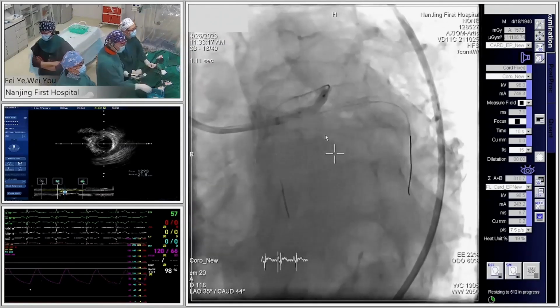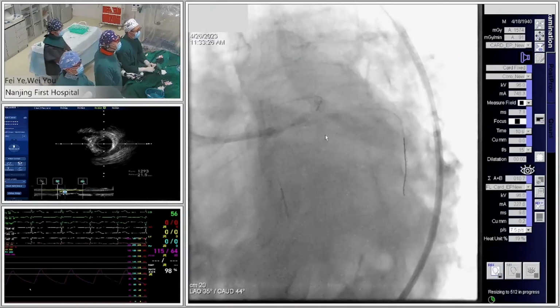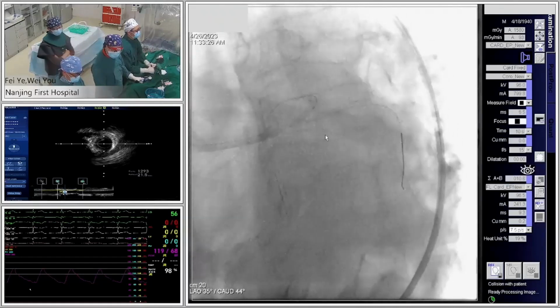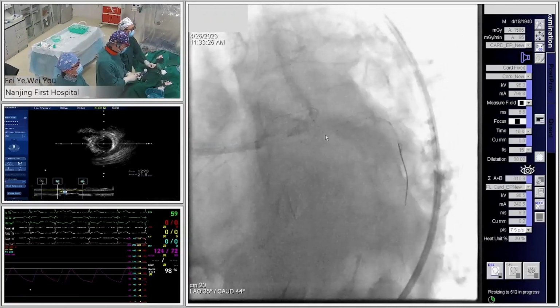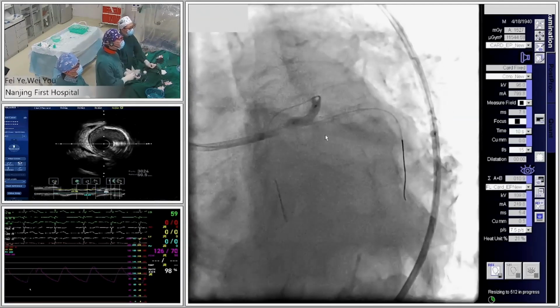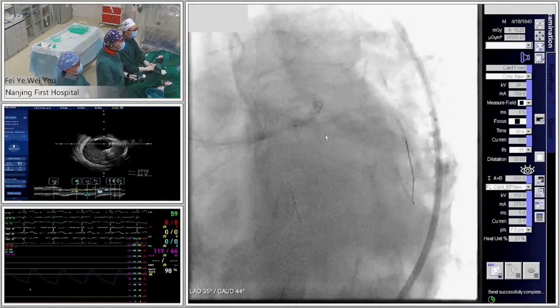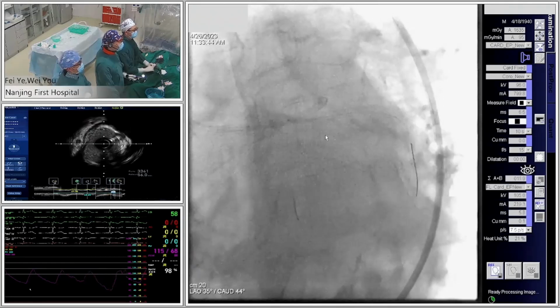Okay, we can use a lower dose of 2B3A. Give me 2B3A. Is there any attenuation? Okay, plaque. Once more, the LAD proximal? 12, 14. LAD plaque is also a calcified lesion, without any soft plaque. No attenuation plaque. Yes.